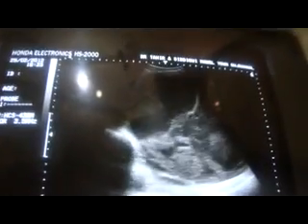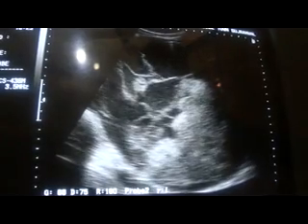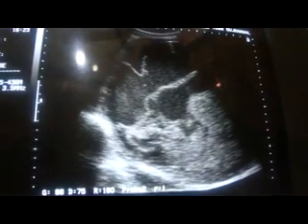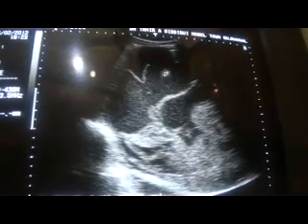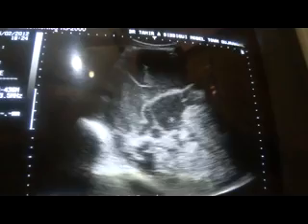These are all septa, and you can see floating echoes within the cystic area that show fine movements. This is all filled with echoes. This is the septum. These are echoes. This is all fine echoes. This is echo. This is septa.